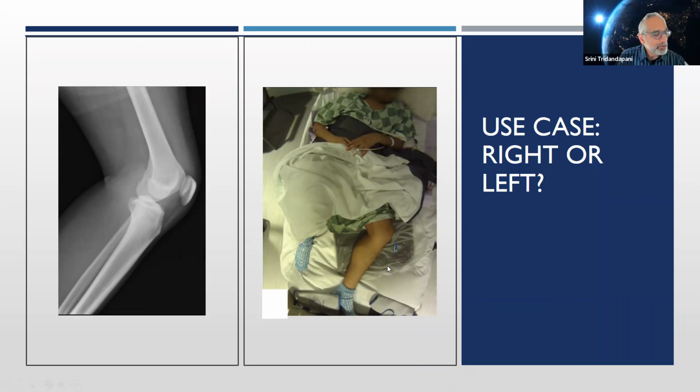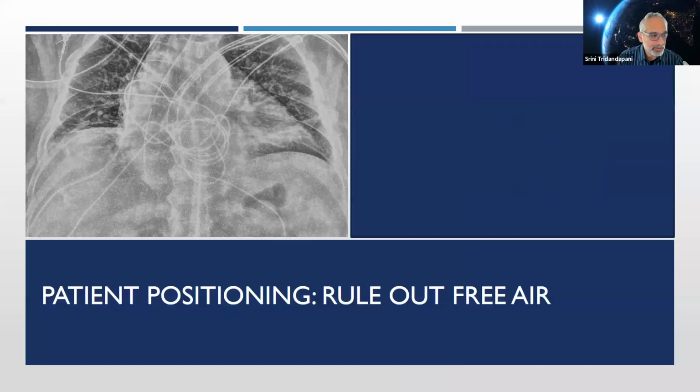In fact, you can actually see the marker, the left marker was here, but when they took that radiograph, it got cropped out. And so they only took a part of the knee and they never included that marker in there. So this can help with quality control. It prevents unnecessary additional studies.